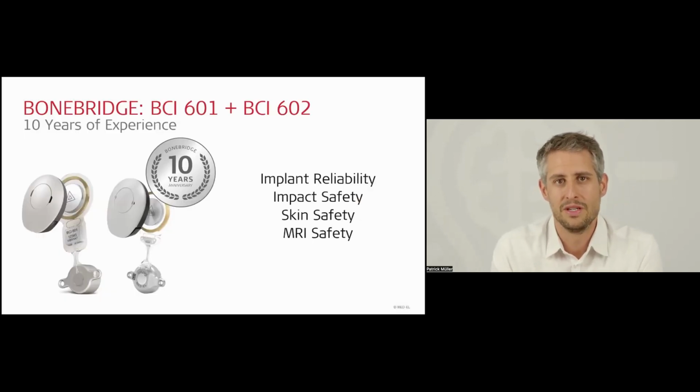Before I introduce you to our speaker of today, I just prepared a few slides in order to introduce you to the topic of today. As we are talking about removing classical bone-anchored bone conduction devices, we have to talk about the reason why we want to do that, and this is usually complications which occur with those devices.